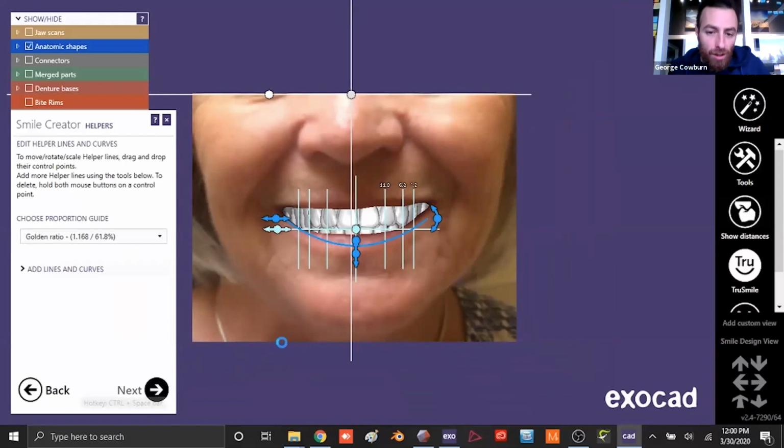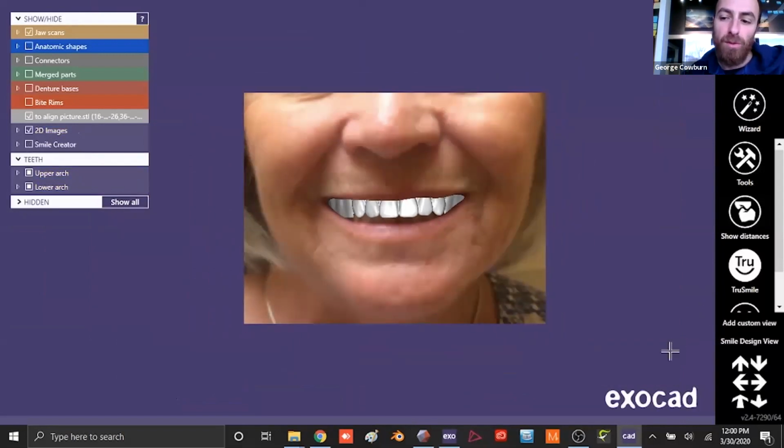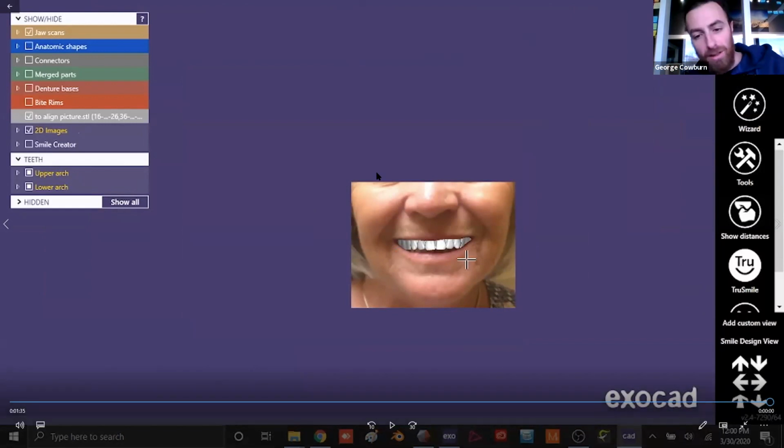And this is another great opportunity to start to engage the patient in their design. So you can ask the patient, what do you prefer? Beforehand, the communication would be 3 layers. The professional, the dentist would ask the patient what they thought, and then based on what the patient thought, they would communicate that to the lab.